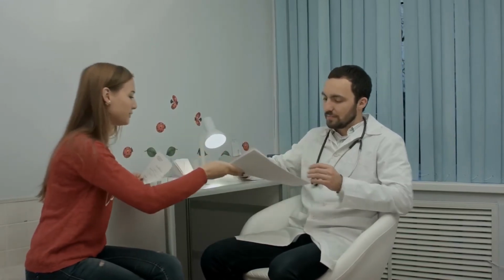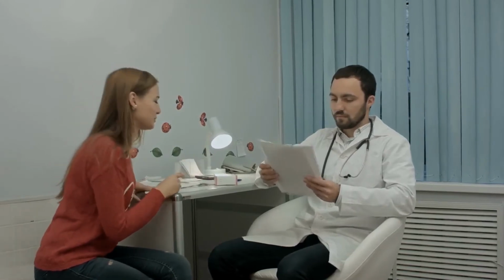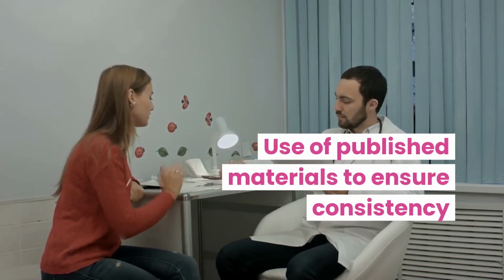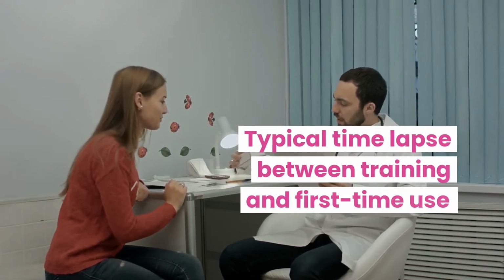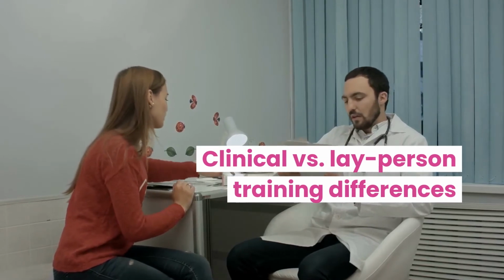Even if clinicians or patients are expected to receive training on the device, unless this training is verified before first-time use, research should be conducted with untrained users. If training is incorporated, it should also be evaluated and iterated throughout the development process. Considerations include individual versus group format, the use of published materials like online tutorials, a training decay period, and clinical versus layperson differences.